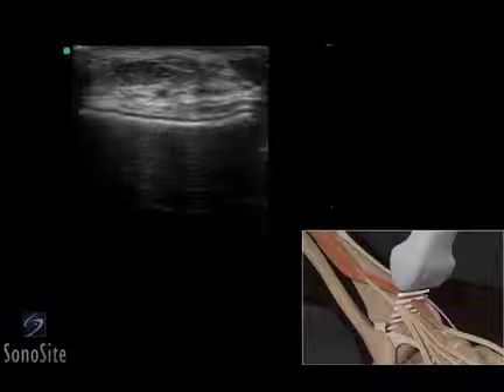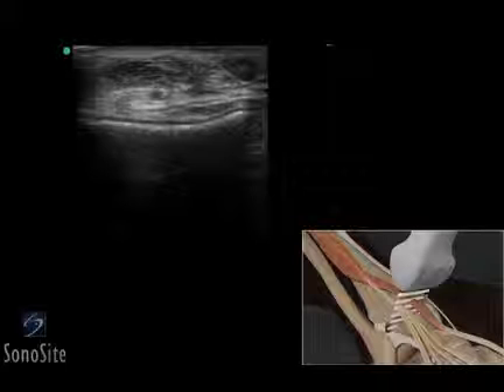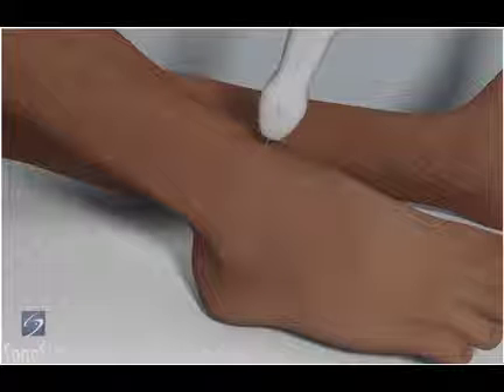A linear array transducer with a musculoskeletal exam type is used to perform an ultrasound examination of the extensor tendon of the ankle. The patient is placed in a supine position with the knee flexed and the foot on the bed.